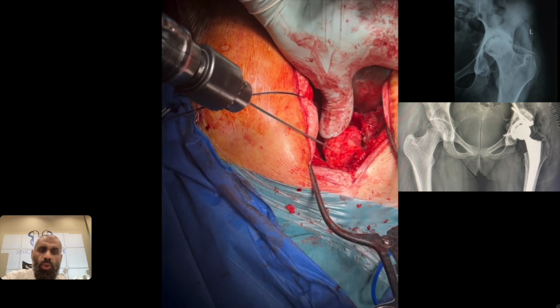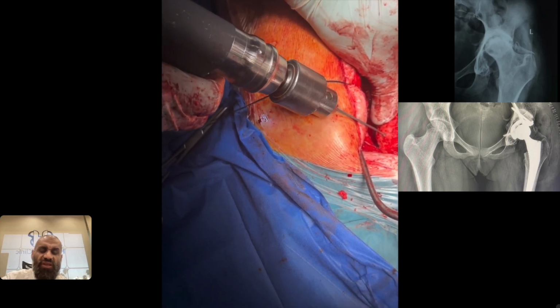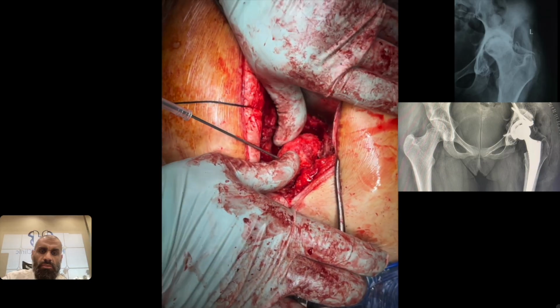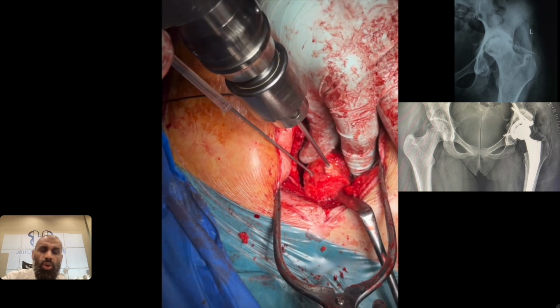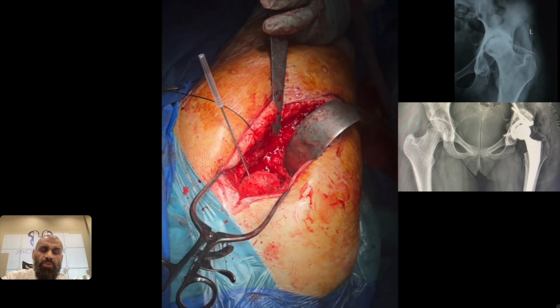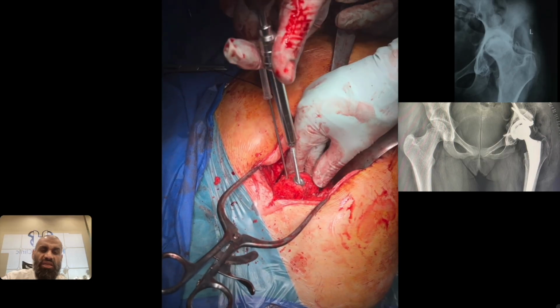After fixation, we will ream the periphery to have structural integrity of the native acetabulum together with the graft, creating a hemispherical structure to hold the cup. The graft is initially fixed by K-wire. The screws should be oriented towards the sacroiliac joint. You can use tactile exposure with your fingers through the greater sciatic notch to exclude premature penetration of the screw into the notch. So the screw will remain in the cortical corridor towards the sacroiliac joint. Usually the screw length is from 60 to 70 millimeters.